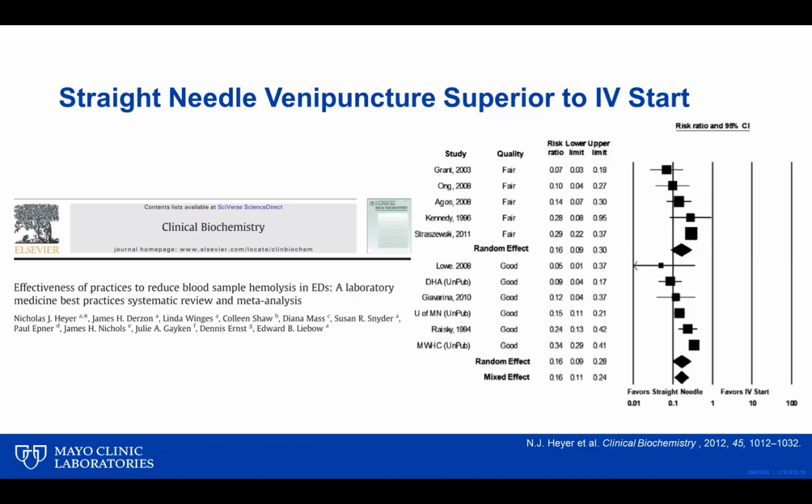So this example clearly shows that we need continuous improvement with automation, and not to forget the contributions in the pre-analytic testing areas. Some hints include working closely with collection areas to get the sample you need, being careful of workarounds that pop up, and focusing on identifying and solving the root cause.